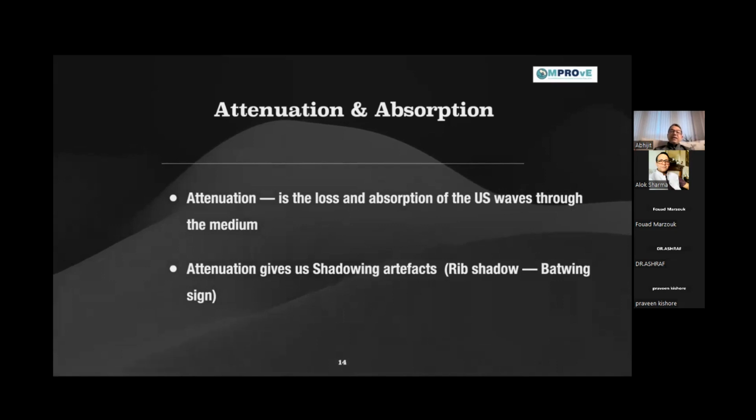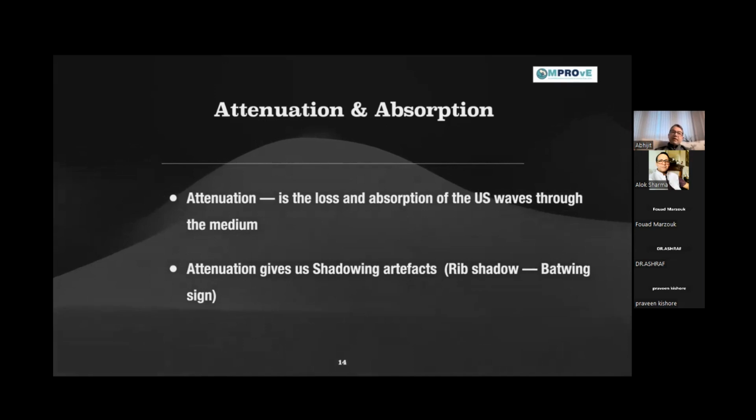With the same energy, you need more effort to walk in water. The same thing happens with ultrasound waves. When passing through the medium, depending on the viscosity of the medium and how dense it is, the waves lose some of their energy, and that loss of energy is attenuation.